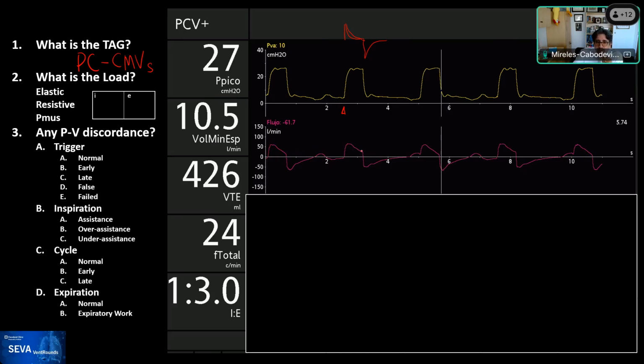Your waveforms are not going to look as pretty. They may have distortions from the flow moving back and forth, but you can rapidly see it's coming back. There may be some exponential decay. It's not perfect, so I'm not convinced, but at least it doesn't look like the resistance is increased.